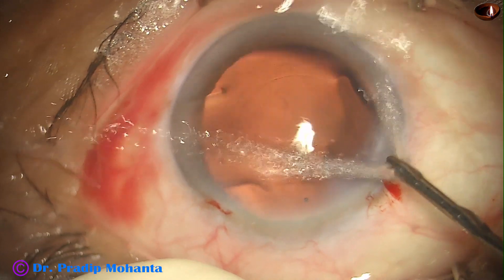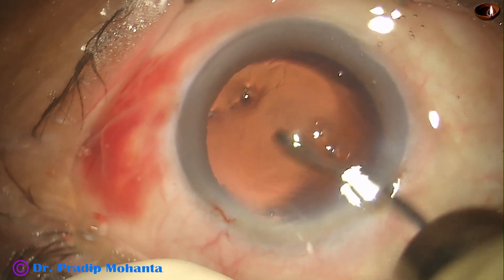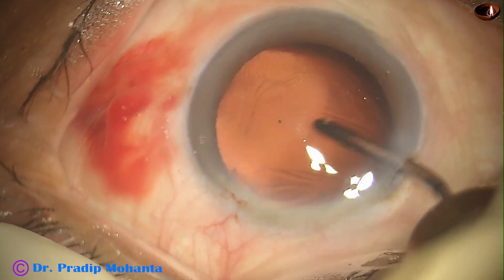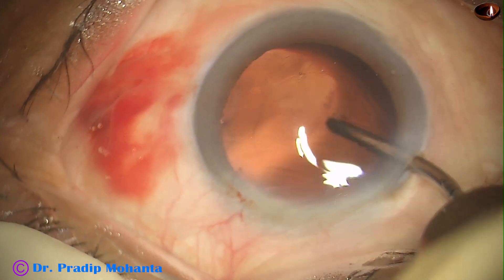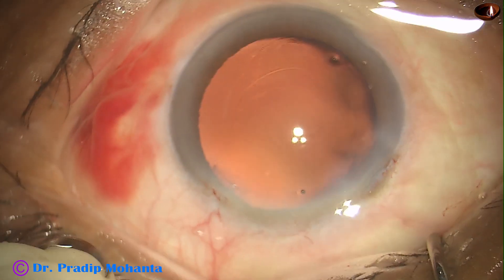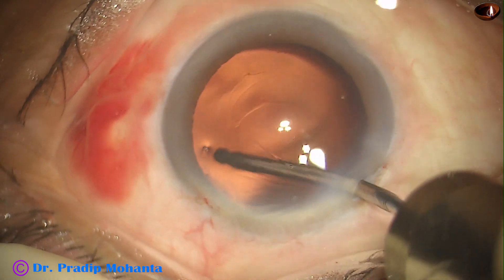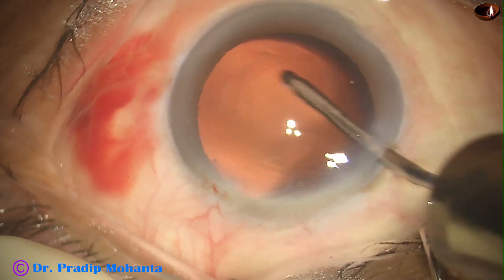This is hydro-polish. Irrigating fluid is swept over the posterior capsule, and the cells that stick to the posterior capsule get dislodged, so the posterior capsule becomes very clean.